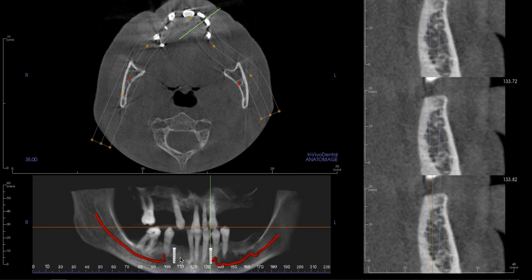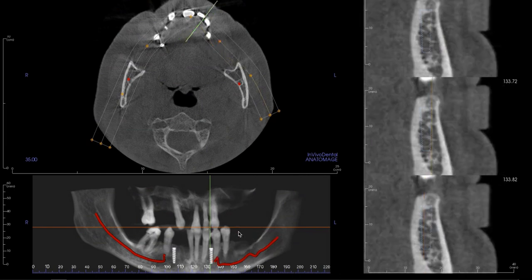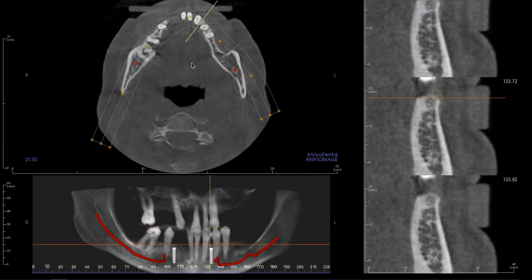So here we're kind of nudging up against the canals. I think if we take this implant and we put it here, we're going to have a better anterior-posterior spread. The reason why it's important to consider where you place these two implants — the farther back you go, and I'll use the arch form to have that conversation — it has to do with the AP spread. If you go back farther here and here, there's going to be a larger anterior cantilever that causes rotation around that fulcrum between the two implants.